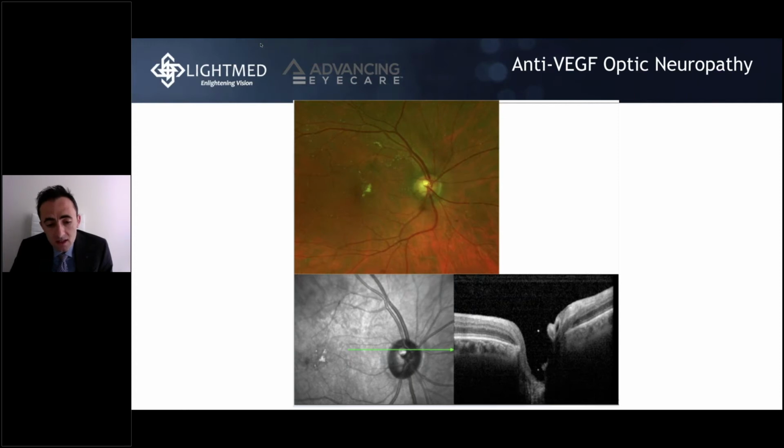And when it got stuck in that location, it was present in the blind spot that is associated with the position of the optic nerve. So it was not visually detrimental, but this is something also to think about. I have some other patients who tell me that they can see these silicone oil droplets because it usually floats within the superior vitreous cavity, and some sensitive patients are bothered by it.